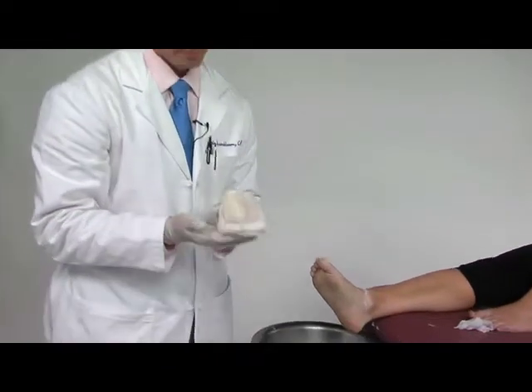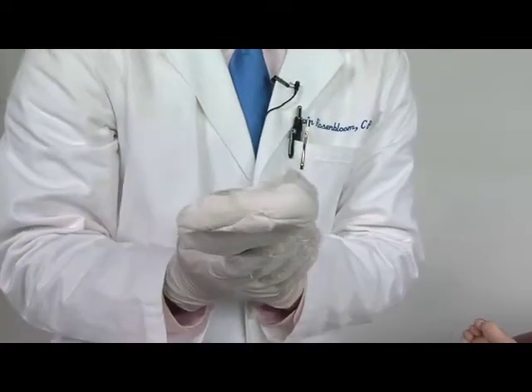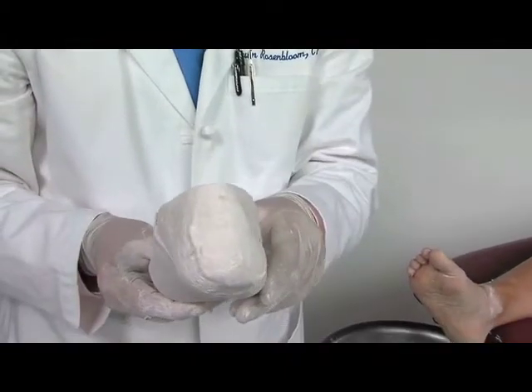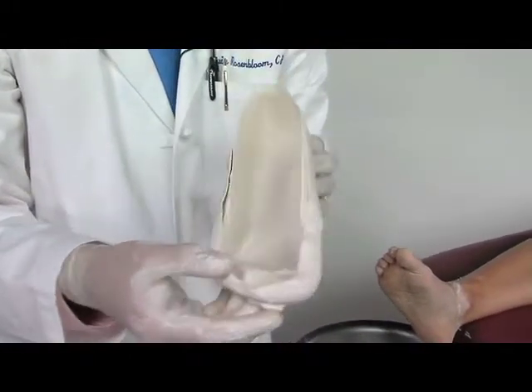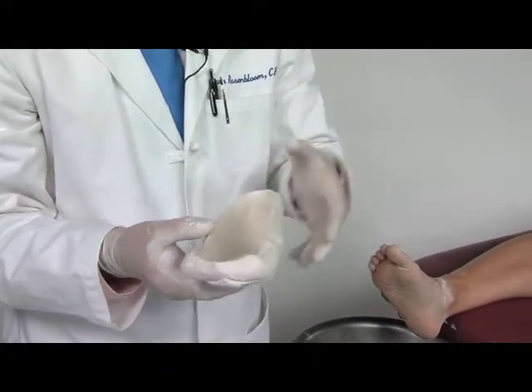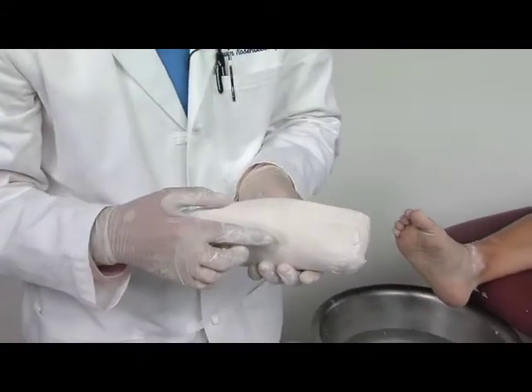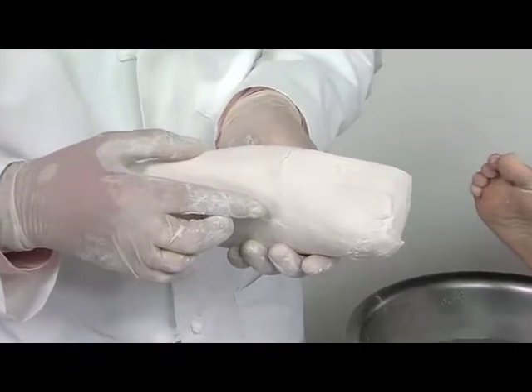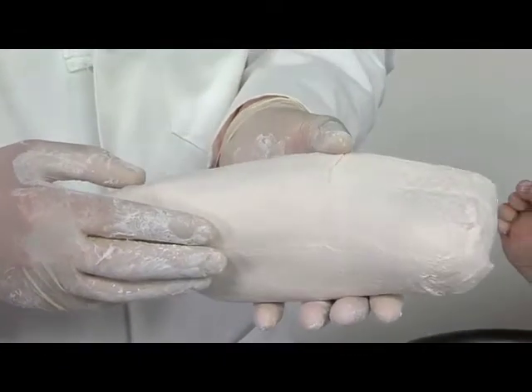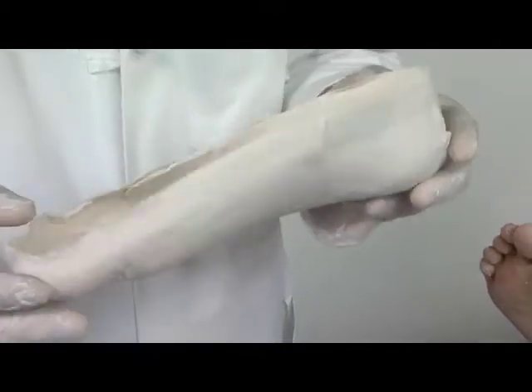The wrinkles and the forefoot are in great alignment relative to the rear foot. We've got a nice heel cup — we'll typically add about an eighth of an inch of plaster in the heel for fat pad expansion. We'll lower the arch about an eighth of an inch if requested for fat pad expansion, or allow a little bit of pronation in the arch if needed.